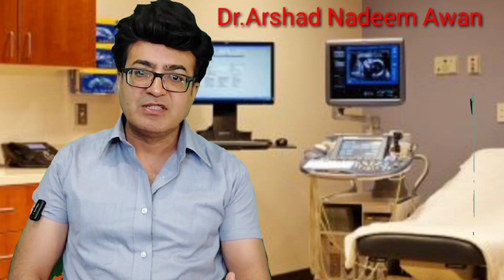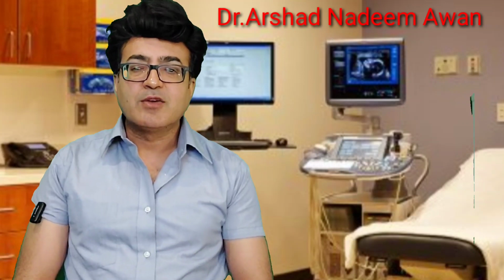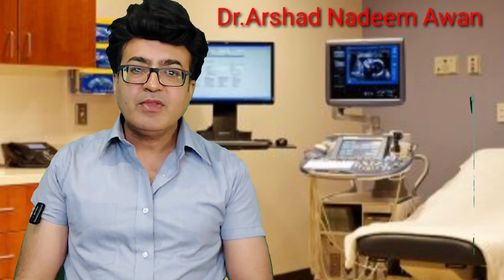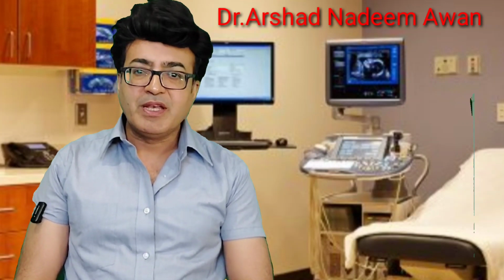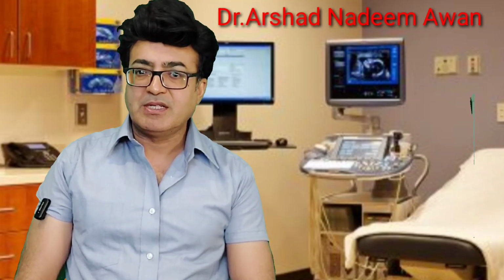Actually it's a complex of diseases, so if all these areas are involved and inflamed, that would be considered as pelvic inflammatory disease. The long-term sequelae of pelvic inflammatory disease include infertility, pelvic pain, and a great chance of getting tubal or ectopic pregnancy.